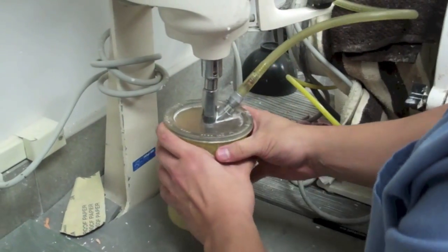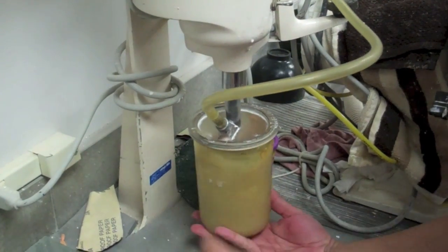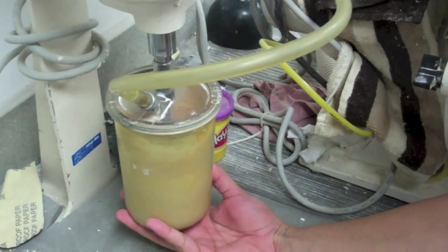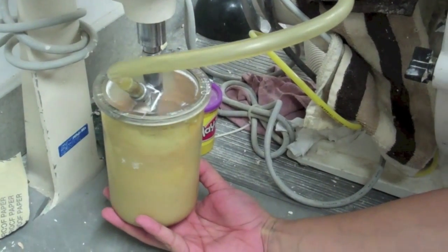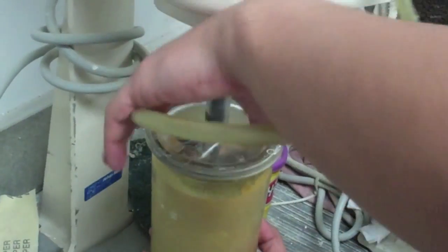When ready, place the Wipmix bowl inside the mixer. It should start automatically. Leave it mixing from anywhere between 20 to 30 seconds. When time is reached, remove the bowl from the mixer.